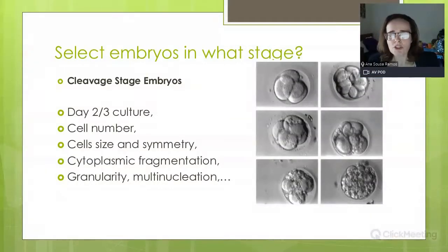And usually to select these embryos, when we're talking about cleavage stage, we base our selection on factors like the number of cells they have, the size of the cells and the symmetry, the cytoplasmic fragmentation that may exist, the granularity, multinucleation, and a lot of other aspects. And regarding these different things, you can consider different grading as you are going to see further.